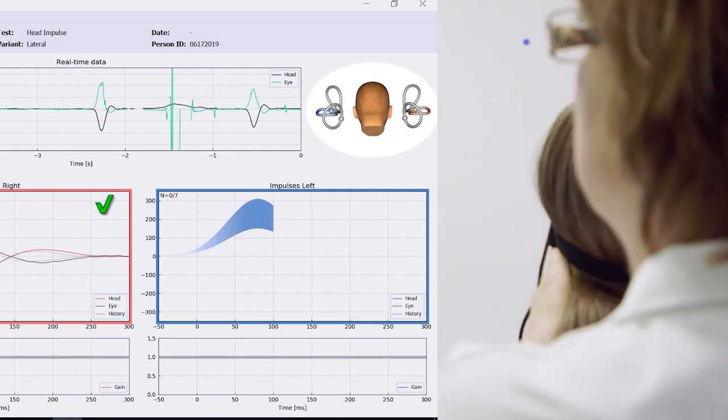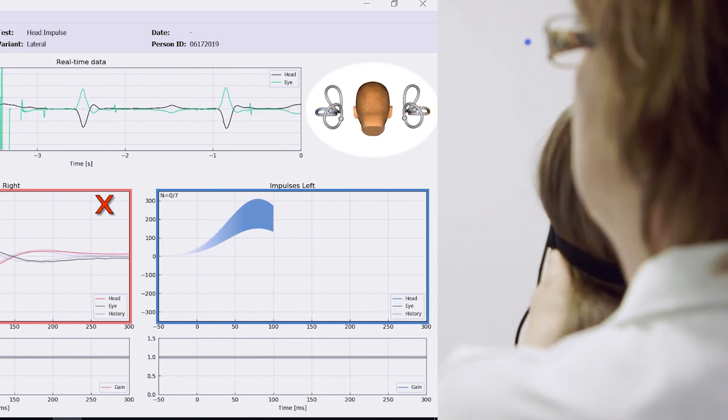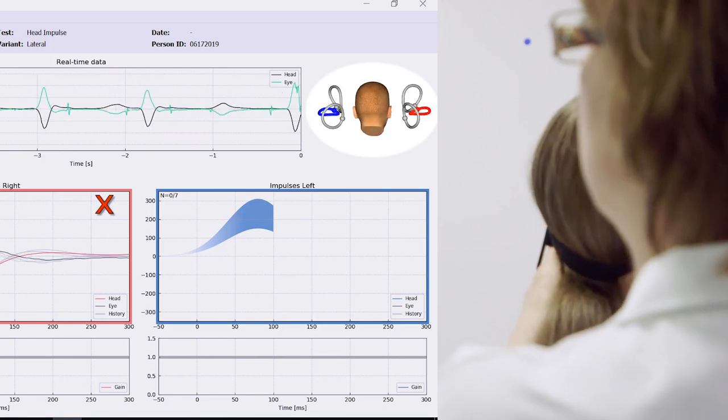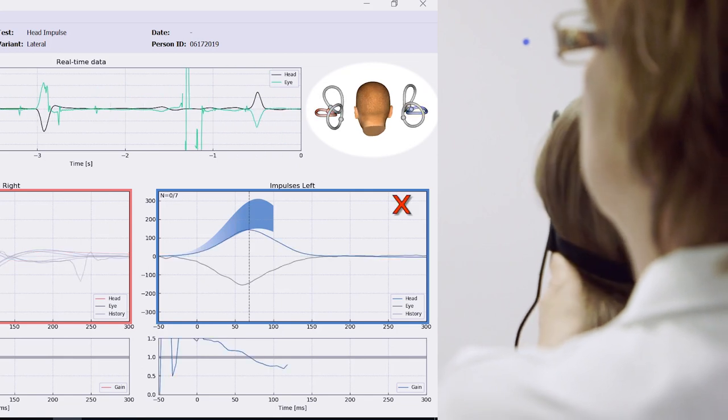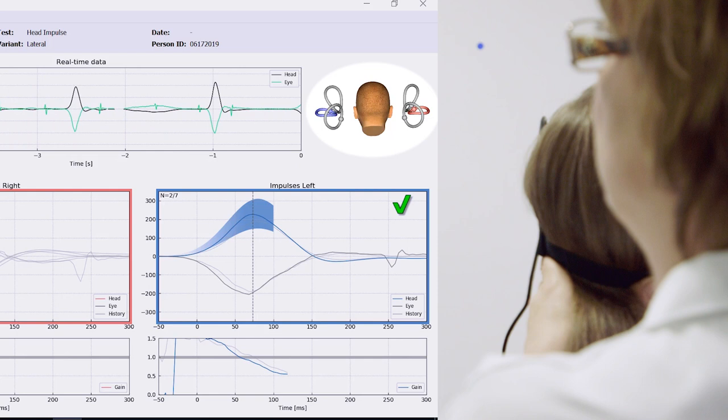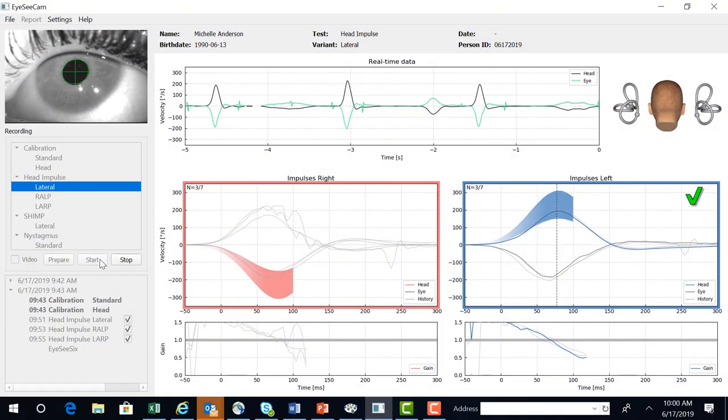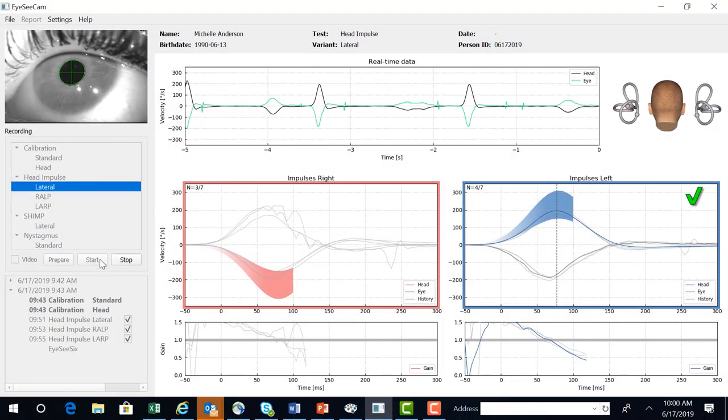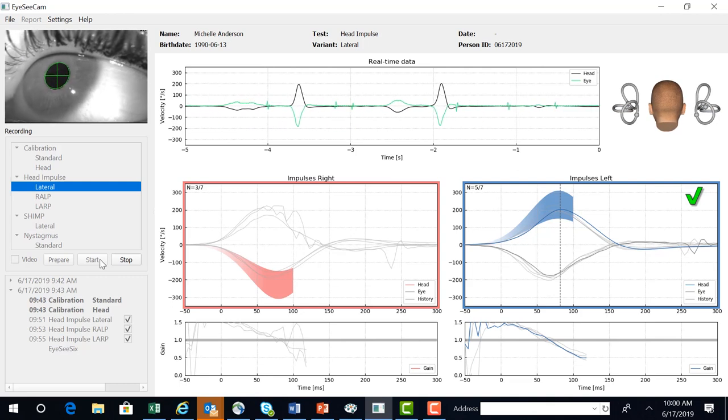And that is because I am exciting, with a right head impulse test, exciting the right canal, inhibiting the left. When I go the opposite way, you see the left canal turn red and the right canal turn blue, because now I'm exciting the left and inhibiting the right.